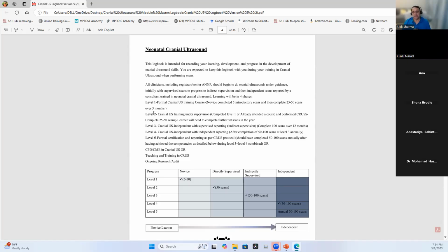And experience says that it's not the number that is important for us, it's more your learning curve. And I know people who have done 10 lung ultrasound scans, and really their machines and their ability to scan was even better than mine. And I've done hundreds. So trust me to say that that learning curve can be quite short for some people. And for some people, it may take longer.